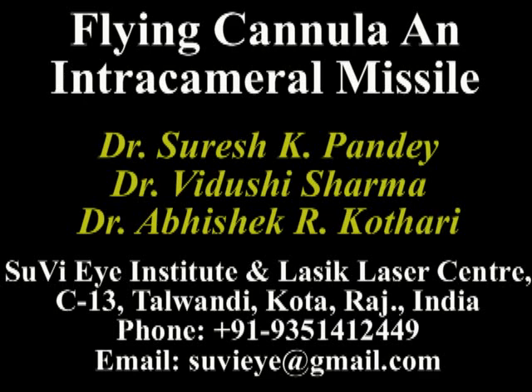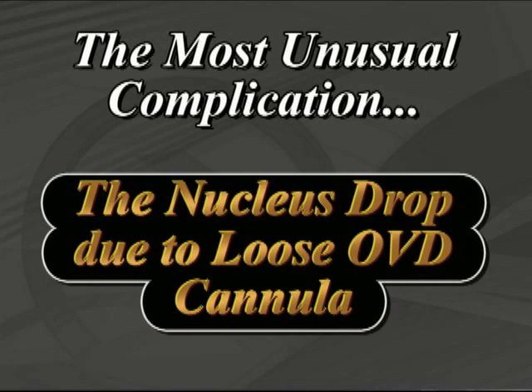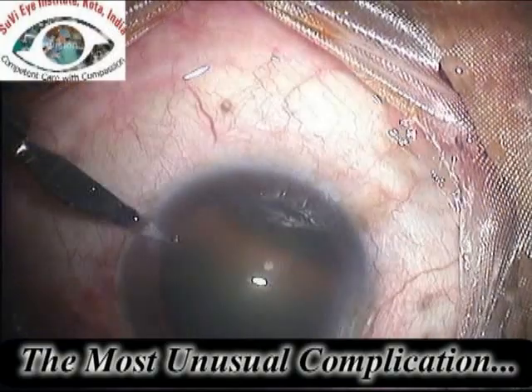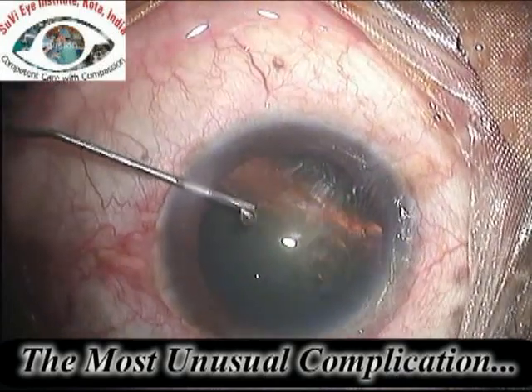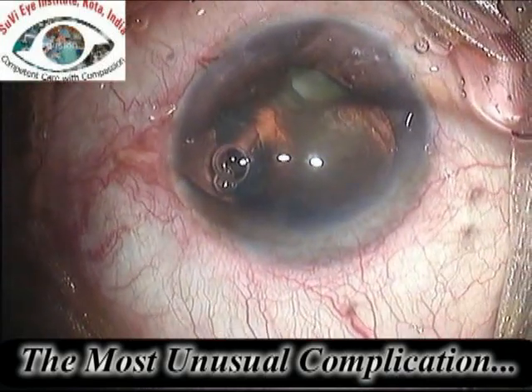In this video we describe a very unusual complication of a nucleus drop that occurred due to a viscoelastic cannula and its management using a glued IOL. As soon as the viscoelastic was introduced, the nucleus drop occurred because of the impact of the cannula — probably because the viscoelastic was either stuck in the cannula.